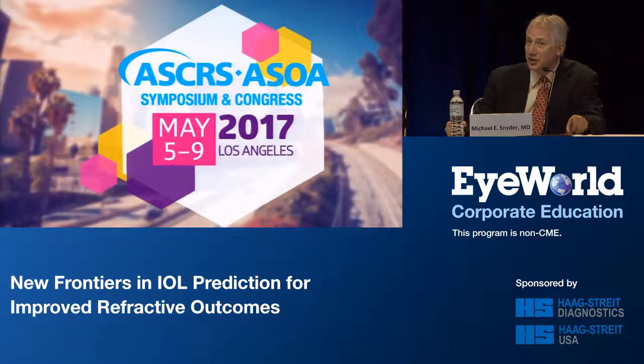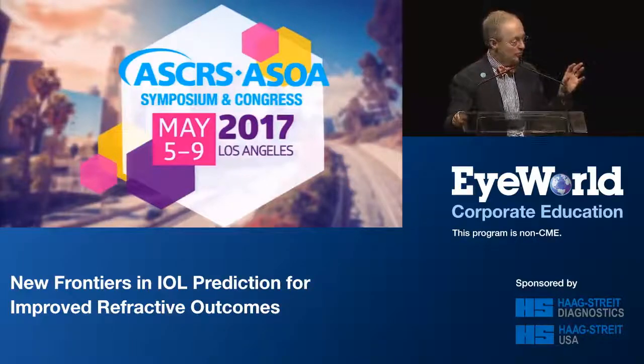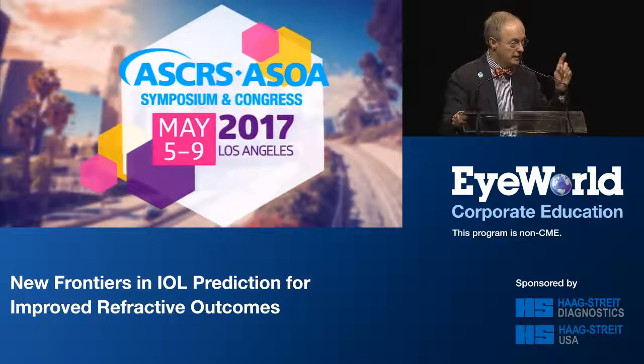That can be particularly challenging if you have patients that have ocular surface issues or they can't hold still very well. If you have four good measures and a couple measures that the patient moved a little bit for and they're not as good, with this particular instrumentation, unlike some of the others, we can actually just remove the bad data points and replace them without getting rid of the good data points. And one of the other nice aspects of it is you can actually look at the reflected mires and look at the true raw data, and you can tell right away that that's a bad measurement or a smeared point that tells you there's something amiss, in addition to the numbers that you pointed out.